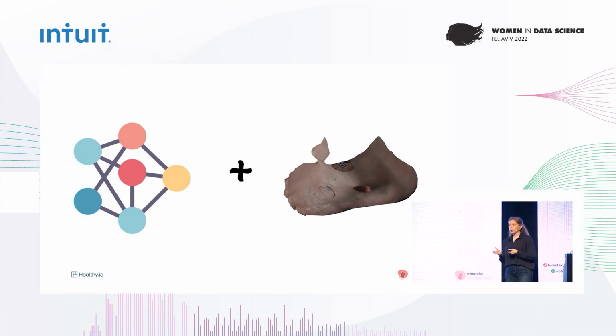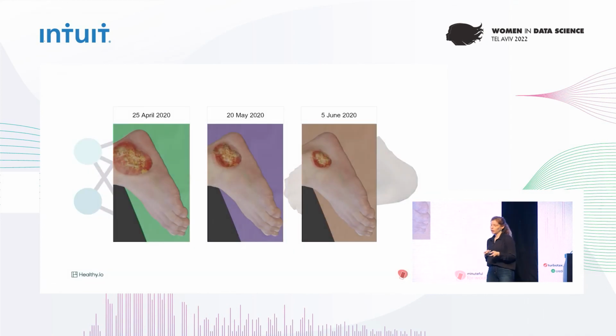And if I summarize what we just saw, we combined here segmentation-based neural network algorithms and algorithms from 3D reconstruction and registration in order to provide the wound nurses a consistent timeline to support them in their work and help them to compare calibrated images between different visits so they will be able to give their patients an optimal treatment.